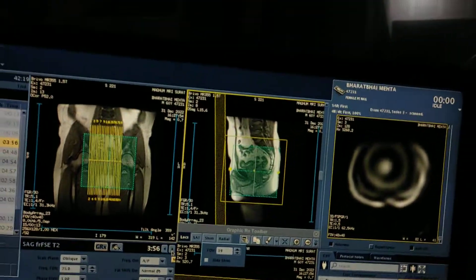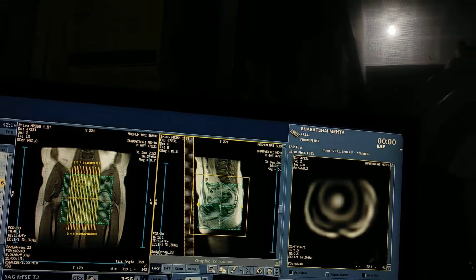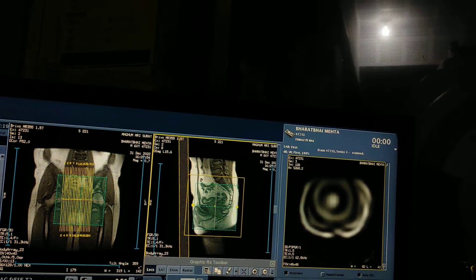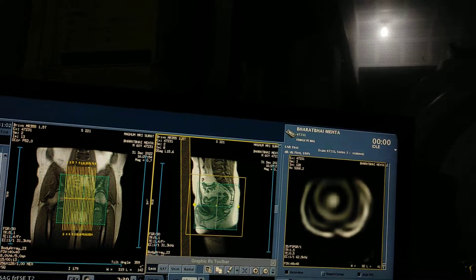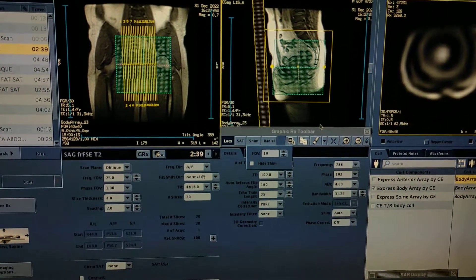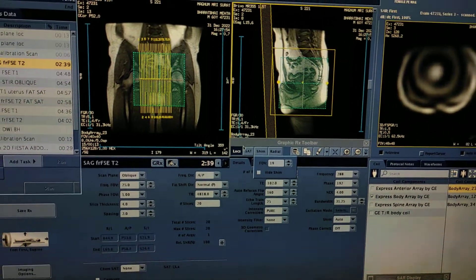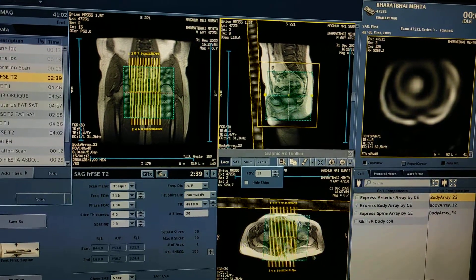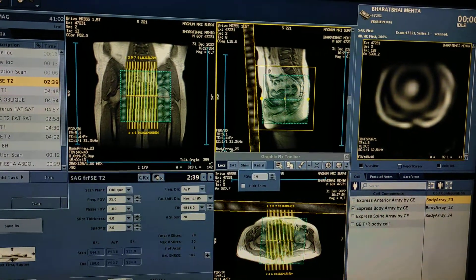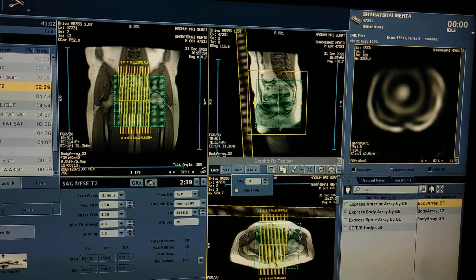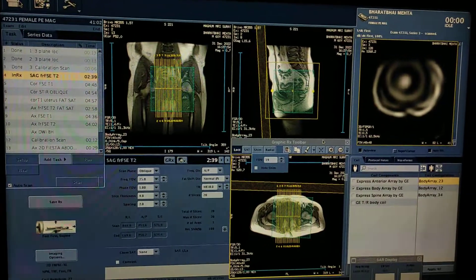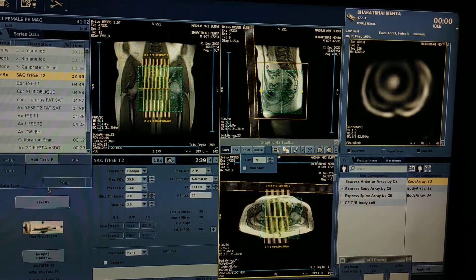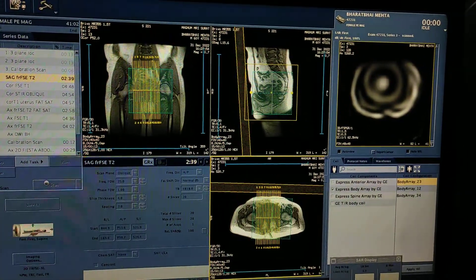Before scanning, ask the patient not to give any movement so you can scan properly. First I will scan sagittal T2, and after getting T2 I will show you the other plannings and positions. Save and run.